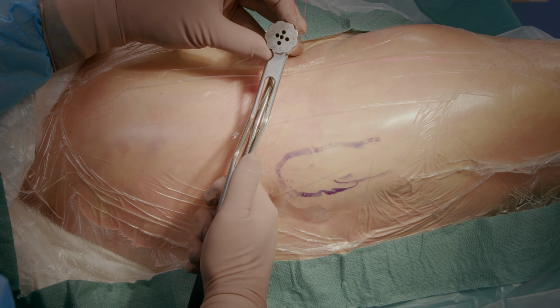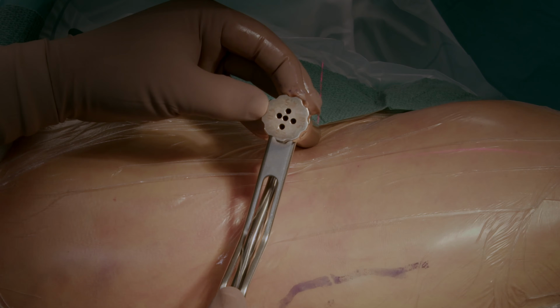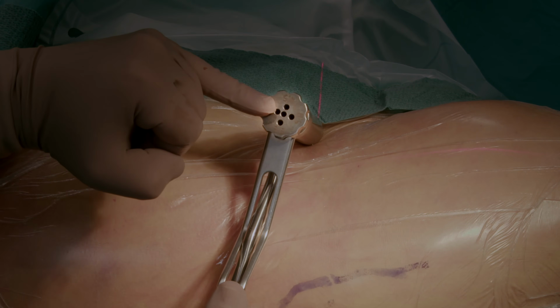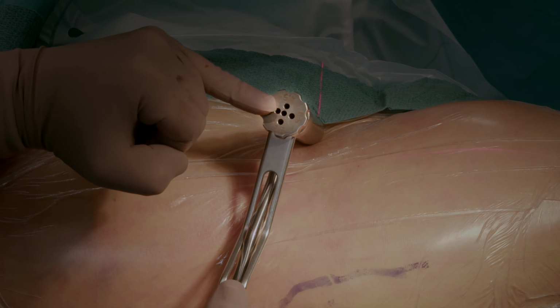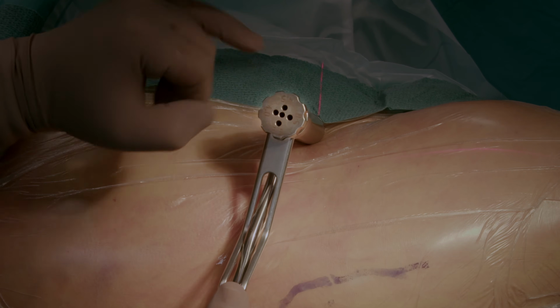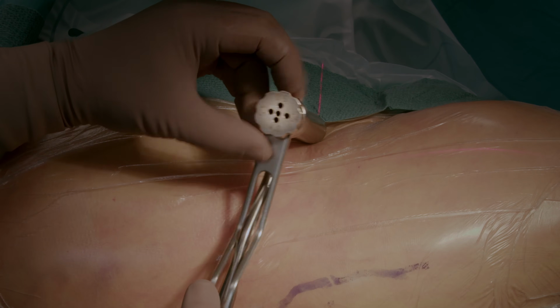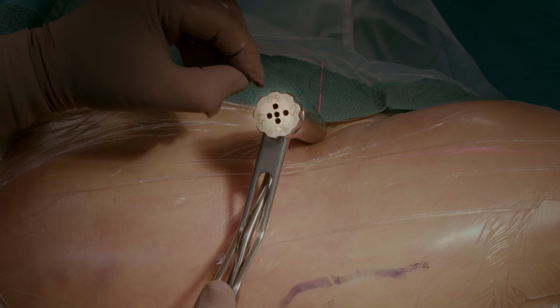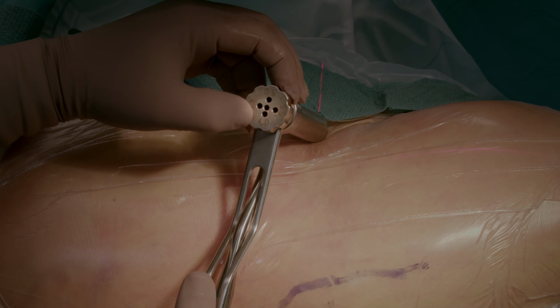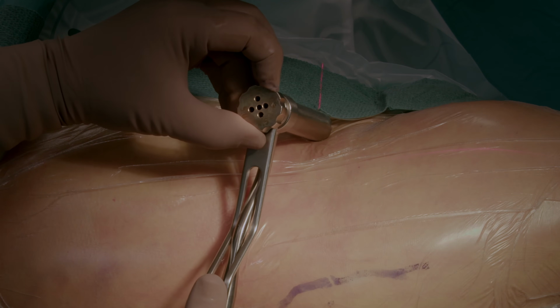For the guide wire insertion, you can use this multi-hole trocar that allows you to adjust the guide wire location. You start by inserting the guide wire via the middle hole, and if in the AP and lateral views the location is not optimal, you can rotate this instrument in the desired direction and move the pin the desired distance. In this case, it allows an adjustment from 4 mm to 5.5 mm in the desired direction.